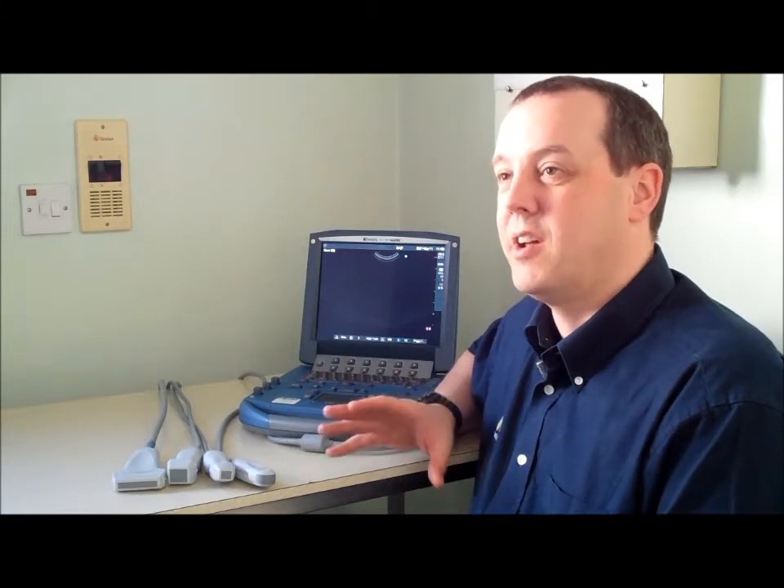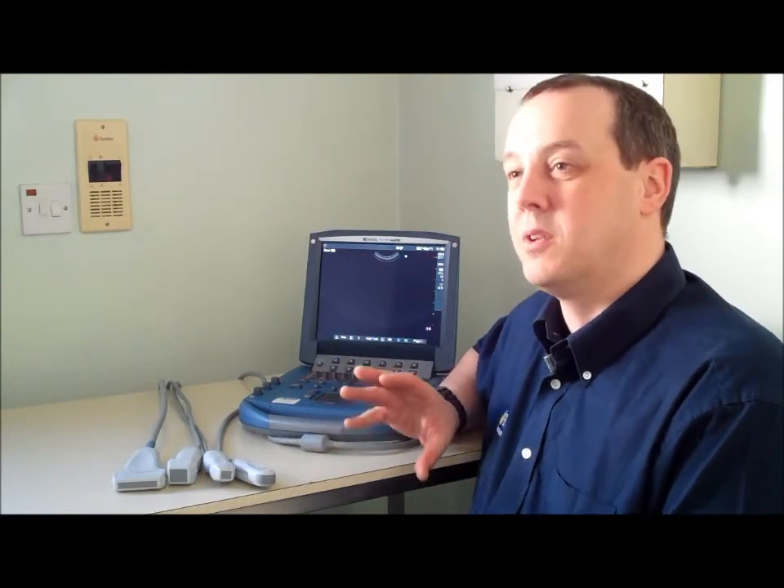The Micromax is incredibly easy to use, which means more vets will use the scanner more often in your practice. It's used on a daily basis for pregnancy scanning, pyometra, liver problems, and especially spleen.